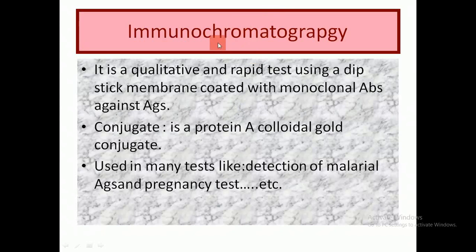Another new test is immunochromatography, which is a qualitative and rapid test using a dipstick membrane coated with monoclonal antibodies against the antigens.